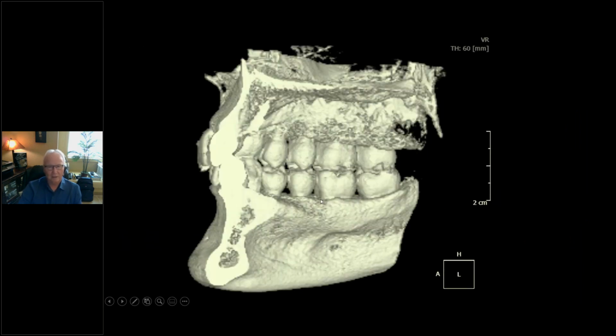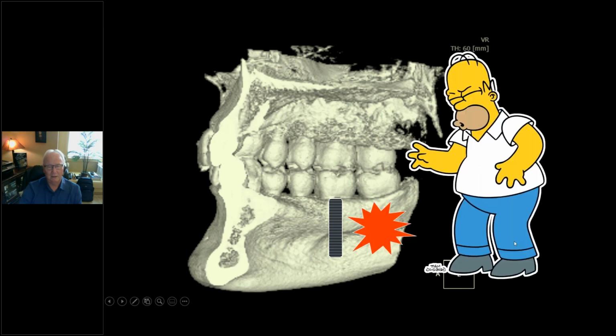So for implants, and this patient obviously doesn't need an implant, but you can see that there's a tooth that if we wanted to replace it, if tooth number 30 required an implant, you'd want to know what the character of the bone was around that, not only the quality and the amount, but also the architecture. And there's no way of actually visualizing the architecture unless you can see all three dimensions. So if you're worried about this, then you've got a right to be worried.